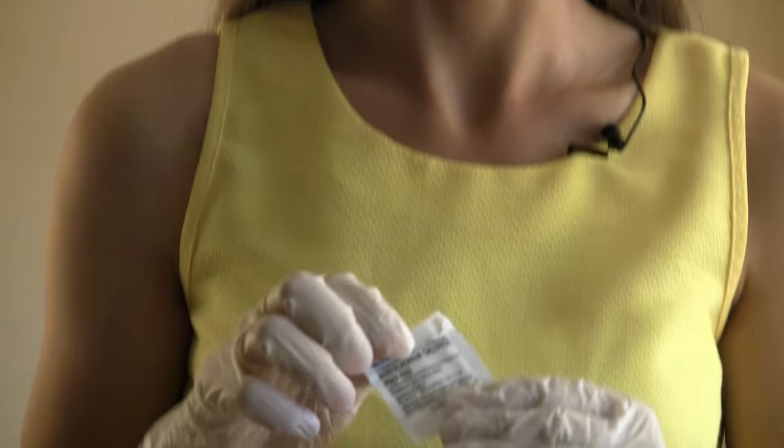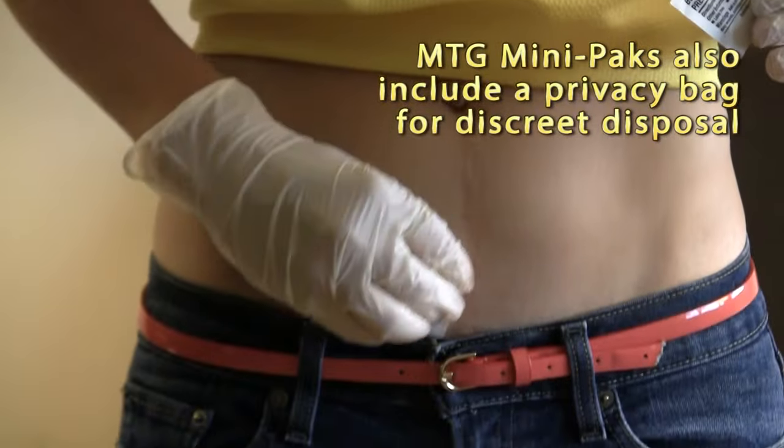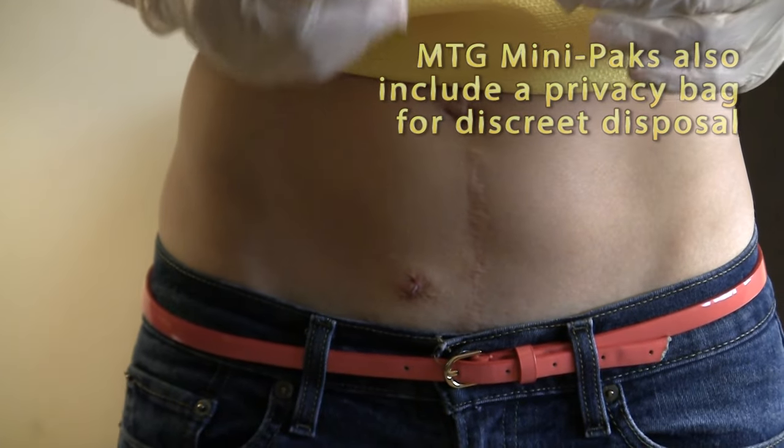If you were to go with the mini pack there's an antiseptic wipe instead of the three swabs. Likewise you just wipe it around the area of the stoma to make sure it's nice and clean once, and you're ready to go.